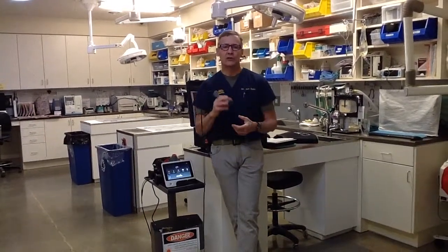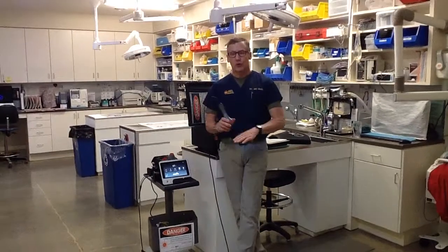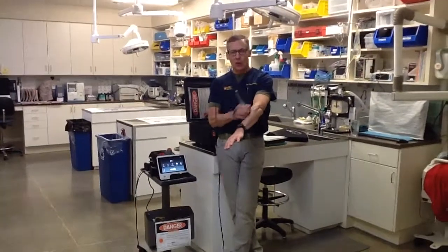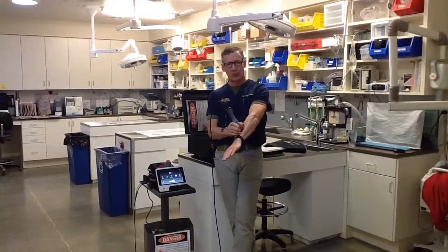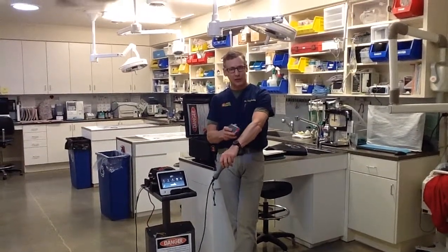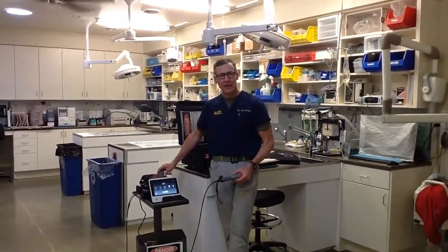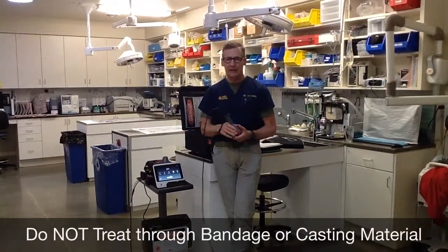There are cases where you use both — like a TPLO, where you use the non-contact head right over the incision and the contact head for the other 270 degrees around the joint. One to three inches per second on the probe — when starting out people tend to go faster, but slower is more comfortable and better. Remember: you cannot treat through any bandaging, casting material, or clothing. Some light gets through but you have no idea how much.